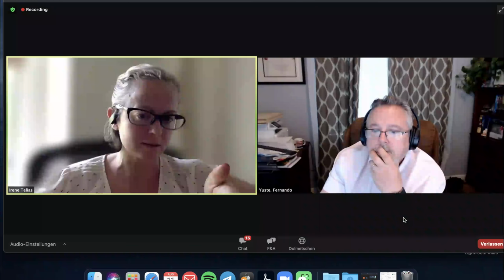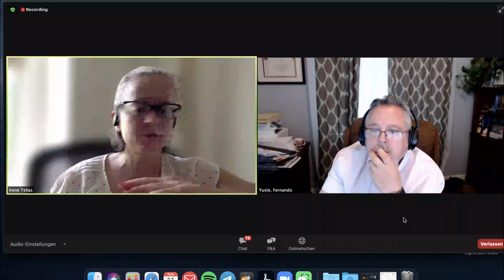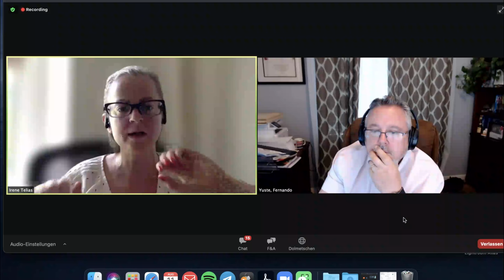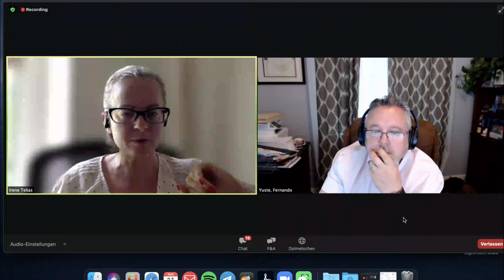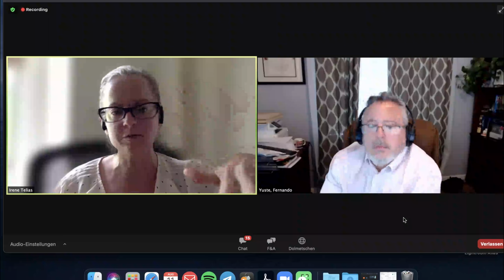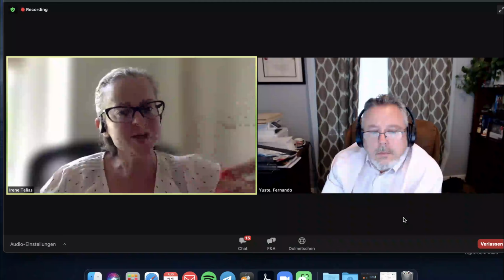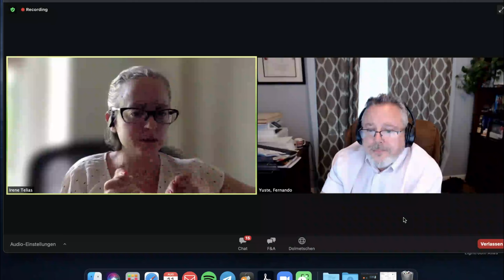potentially benefited from that. The way I do it, I do what we call an R-to-I ratio, which measures the potential for recruitment. It's a one breath maneuver. I say this patient is potentially recruitable or not potentially recruitable. If it's potentially recruitable, I try to use a higher PEEP with whatever method, like express trial, whatever you want to use. But always check that actually the patient is benefited from that, measuring mechanics, oxygenation, hemodynamics.